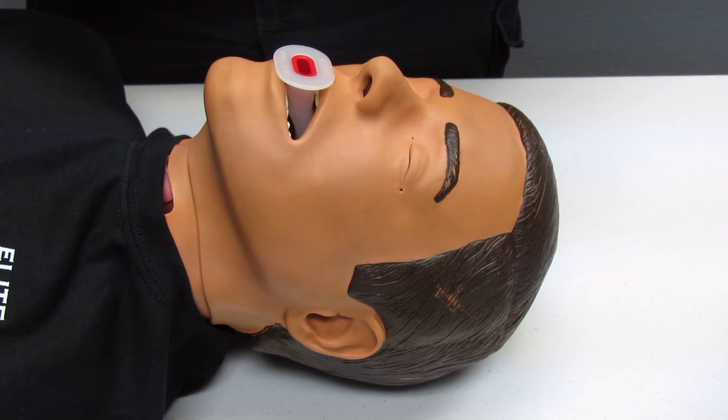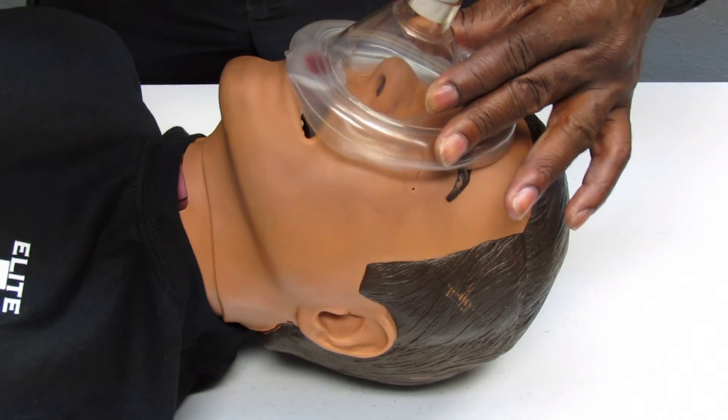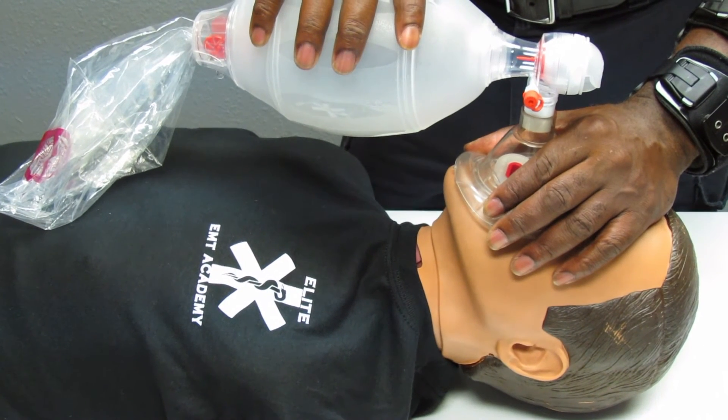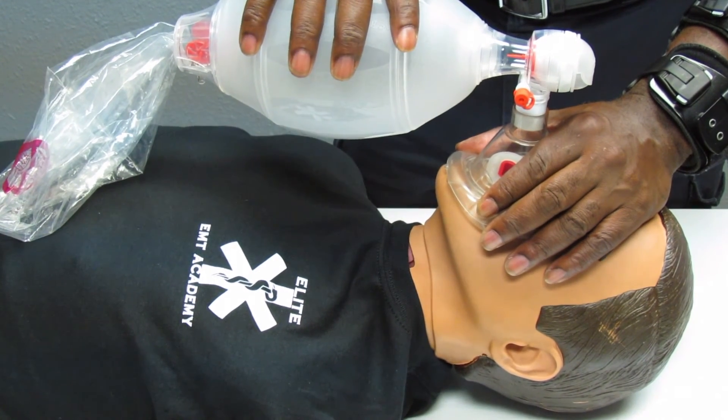To properly fit the face piece of the BVM on the patient, slide the crease above the nose, slide down over the mouth, and create a tight seal using the C-clamp technique. To ventilate the apneic patient, give one breath every five to six seconds — counting one breath, then two, three, four, five before the next.